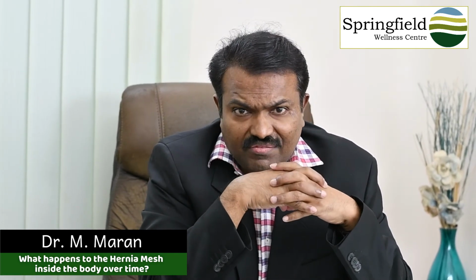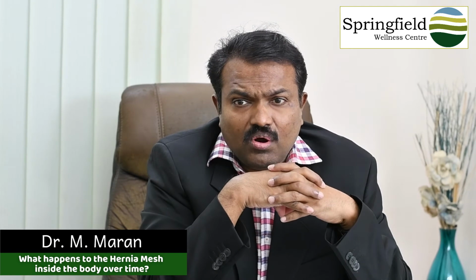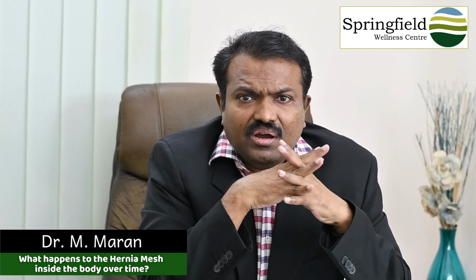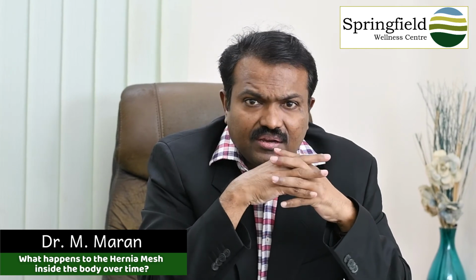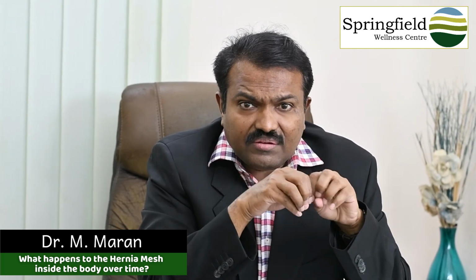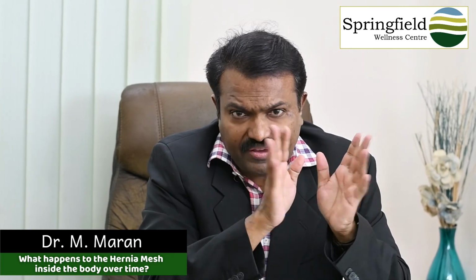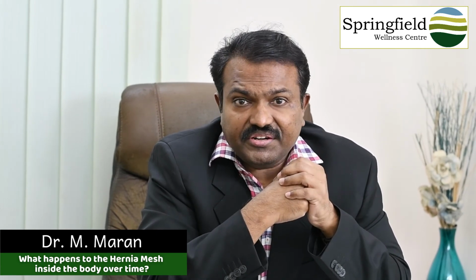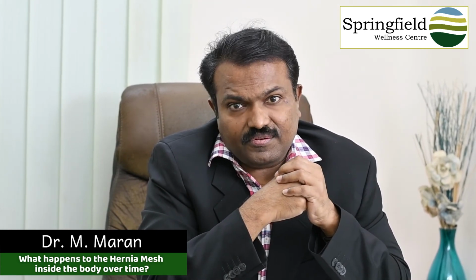These are the complications, but they are very negligible with the advanced meshes available now, and also the techniques involved. So hernia mesh is usually a synthetic non-absorbable mesh which remains in the body, incorporates itself into the surrounding tissues and remains there forever. It's very lightweight, it causes less irritation, and it is safe. Thank you.